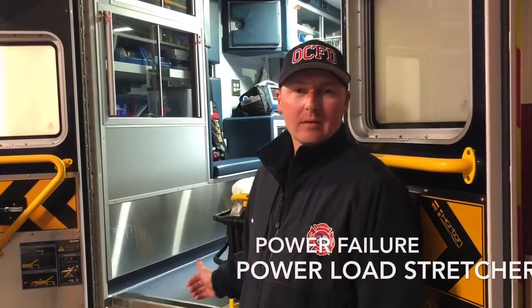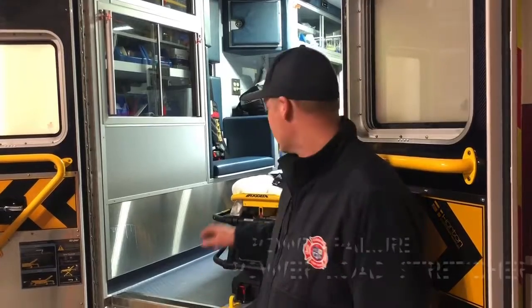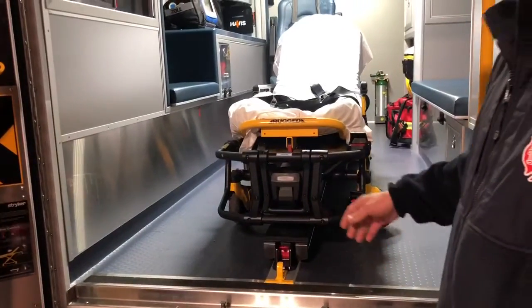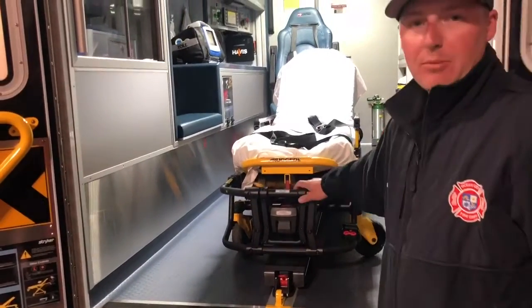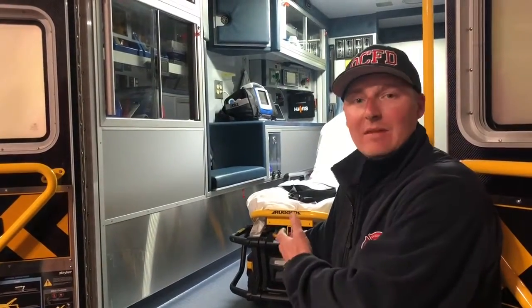Today we're going to be talking about manual operations when you lose power to the power load system — not power to the stretcher itself, but to the power load system itself. This will be operating just like the older ambulances. You will not have the arms holding the patient up as they usually do; you're going to have to manually hold the stretcher up as we did with the older ambulances.